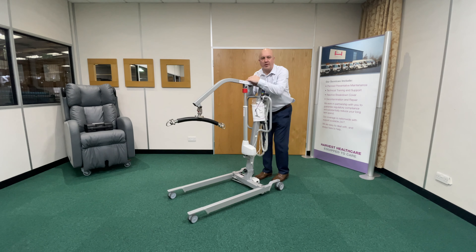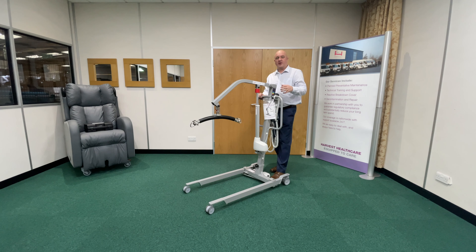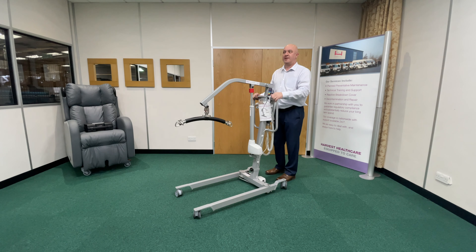Hi there, my name's Chris. Welcome to Harvest's little hints and tips video for use on a mobile hoist. In this case we're using the Olympic 180, but it doesn't have to be — it works with our Pro 185 and other hoists as well.